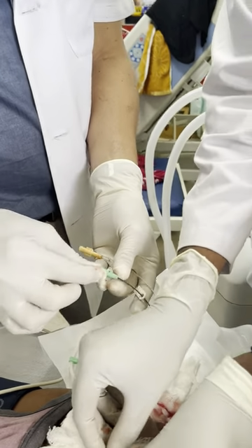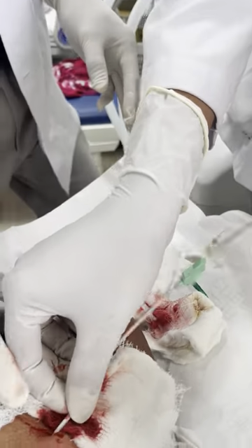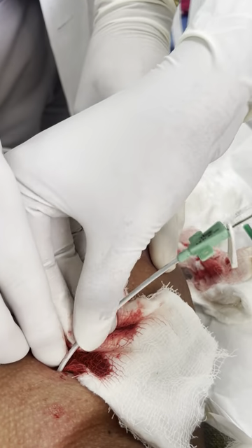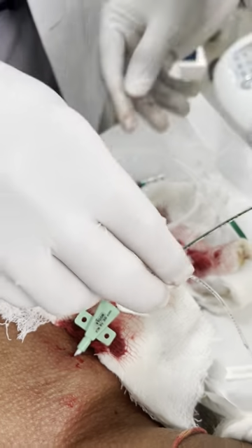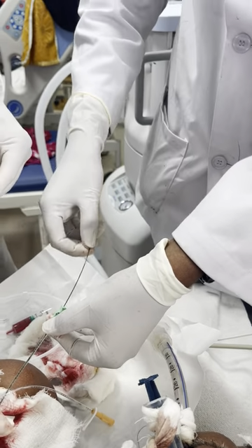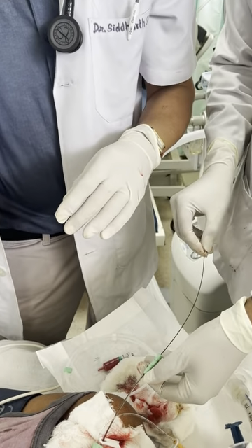Now you can push the line holding this. No. You hold this in your left hand. Very good. And now push the line. Go. Is it going? Very simple, nothing much complicated. Now you will remove this so smoothly. Remove this with your own hands. Very good. So immediately after removing, you will see the gush of blood.